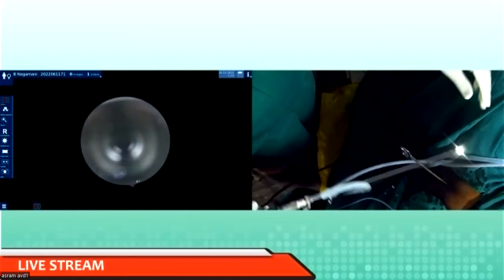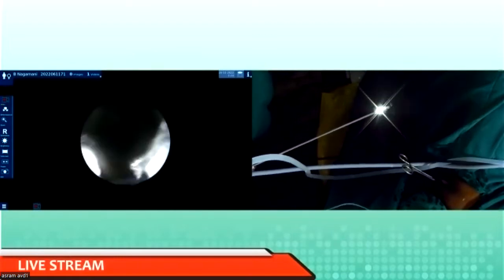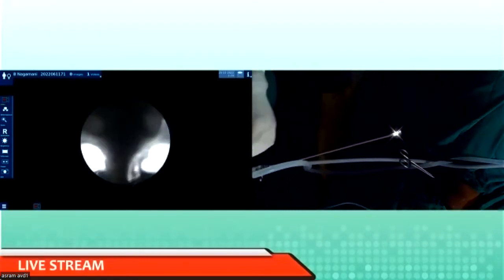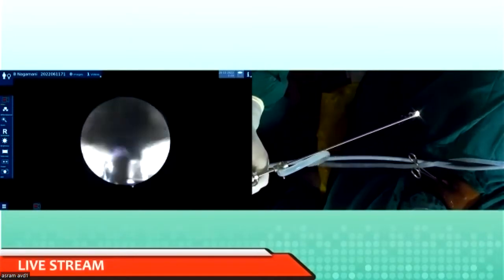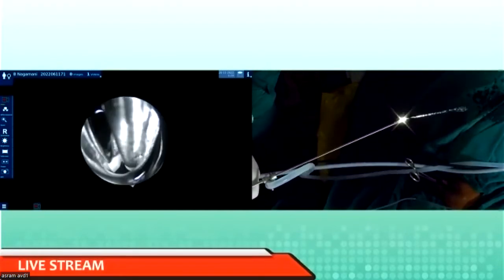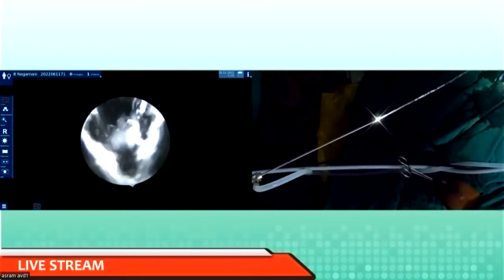Sir. Hello. Yes, sir. Can you look at this? The machine is showing 150, but look at this flow. No, we are not able to see the endometrium, sir. No. Okay. Now look at this flow. You want me to see the flow? Yeah. Now you see the flow. Did you see the difference? Now which was forceful, initial or this one? Second one. And look at this. This is the difference.